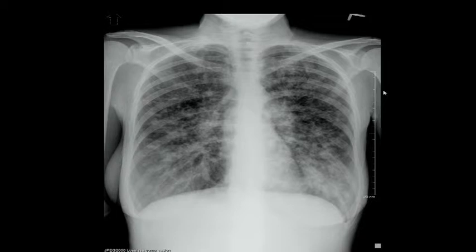No. To call this miliary pattern, you are starting off on the wrong foot. So when I do my chest board review, this is not a board review, this is just a collection of cases, because it's got easy cases and harder cases. But when I do my chest board review, I will tell you that in the examination, they are looking for just 12 things to identify on a chest x-ray, 12 patterns, right? So one is like bronchiectasis, the other one is mucoid impaction, the other one is reticular, the other one is nodular. One is reticular nodular, one is miliary. You just have to know those 12, and you don't need to know anything else.